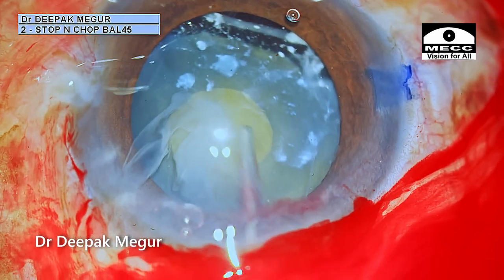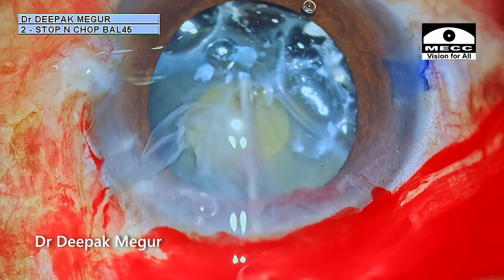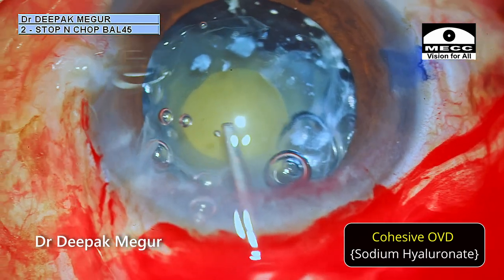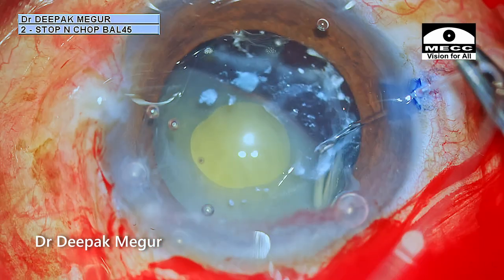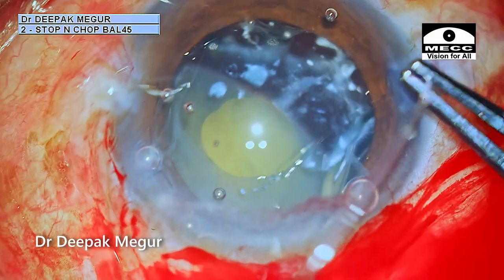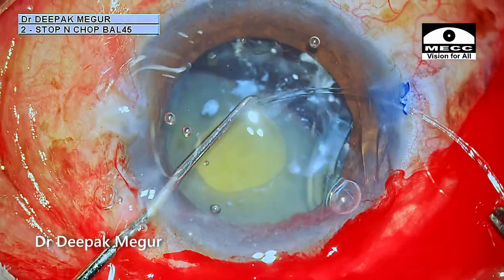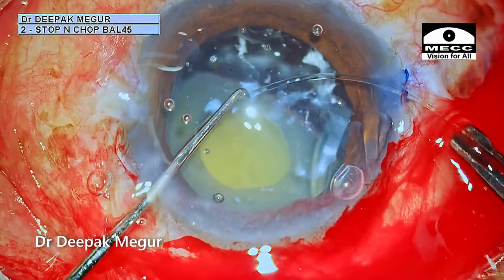By putting the CTR inside it's going to stabilize the bag. Before I do that, I fill the bag and inflate it with a cohesive OVD — sodium hyaluronate — which will create space within the bag and push it across so that when I'm trying to insert the ring it will not cause any stress on the loose bag. The viscoelastic is holding the bag in place until the CTR is being threaded into it.